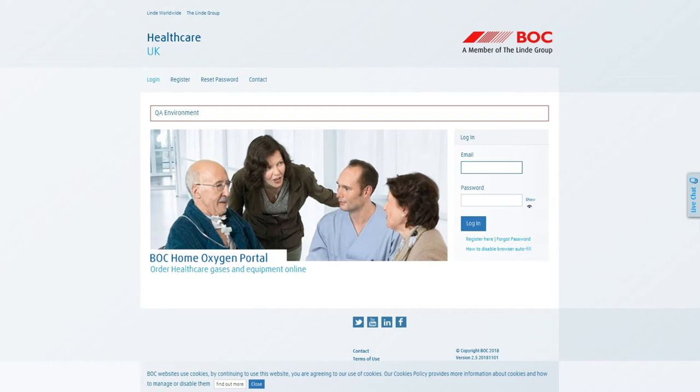This is the first in a series of videos that will demonstrate the many features of the Home Oxygen Portal and how it can make your life as a prescriber much easier, more efficient and can provide you with useful patient information at your fingertips on any modern smartphone or tablet.